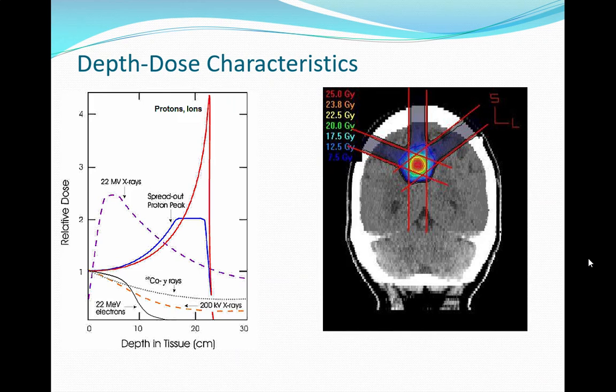Out of curiosity, can anybody tell what view this is? Even just tell phase one. We're cutting it this way, that way. Yeah, so it's left and right. Yeah, left and right. Very good.